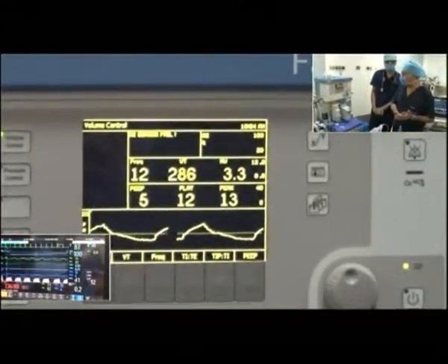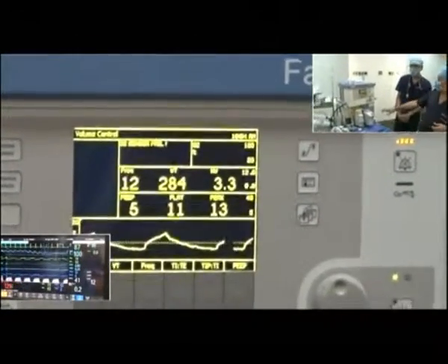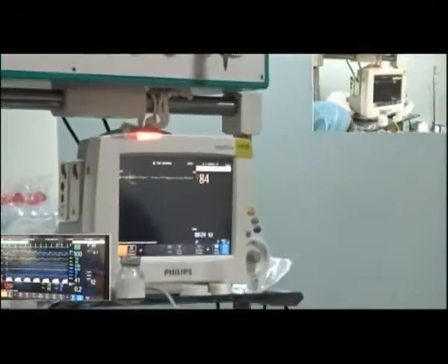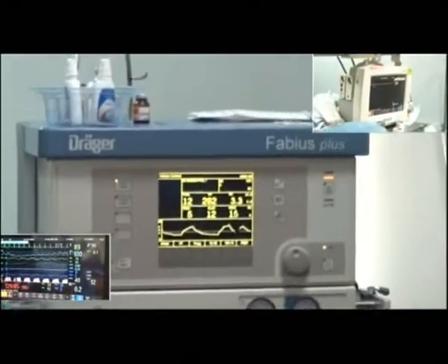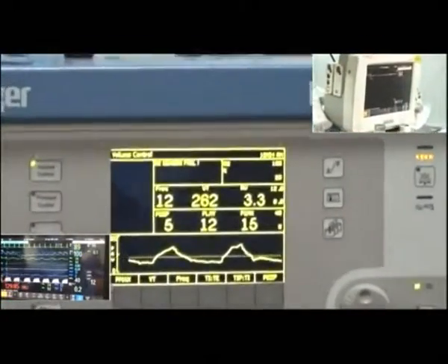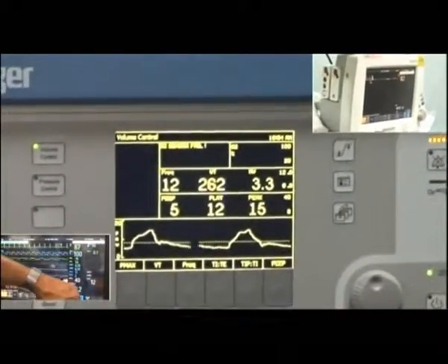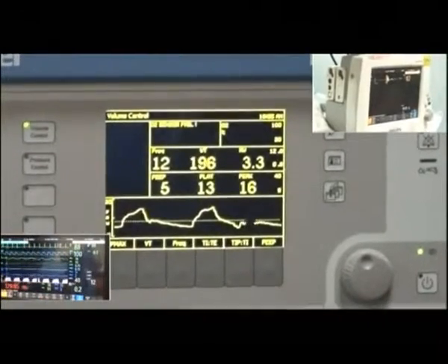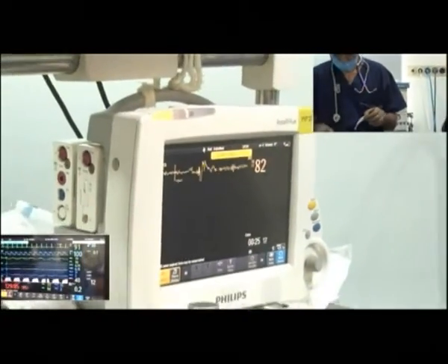So now what the decision making comes as to reversal, and see the desflurane is off, and the concentration of des is rapidly coming down. The BIS is coming up. Yeah, see the max. So that shows how fast desflurane is washed off. And actually, we can take this off. You have neostigmine glycopyrrolate.